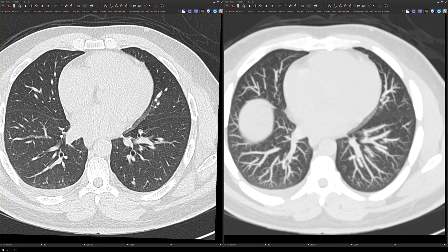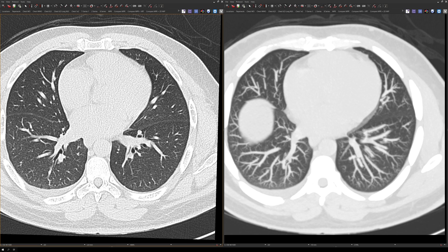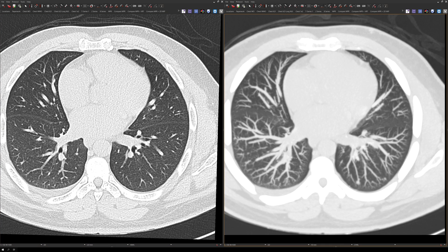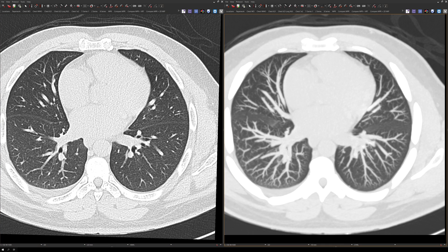Now there is one big drawback to the MIPs: when you're looking for nodules close to the hilum, it's difficult to see those on the MIPs. The reason is there are multiple crowded vessels in this area, so it's easy for a nodule to be obscured in the perihilar region.